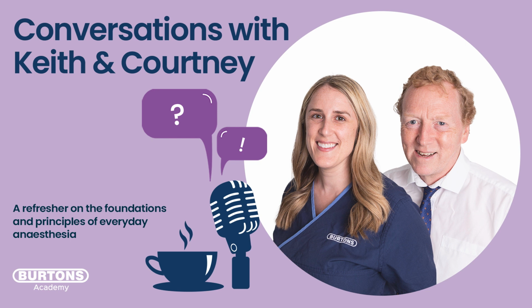So if we were fortunate enough to have a ventilator that does both pressure cycling and volume cycling, versus one or the other, do you have a preference, or why would you choose one method over the other? Okay. I think if you're new to ventilation, then start with volume cycling, because conceptually it makes sense. It's easy to understand, easier to predict, and easier to implement.